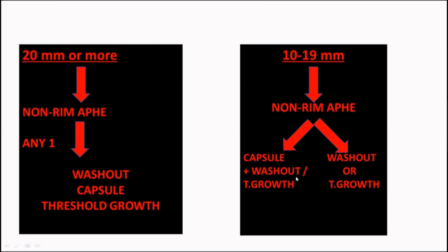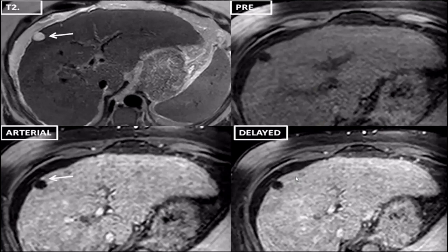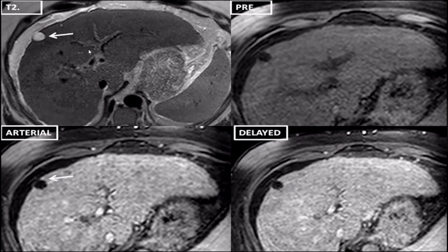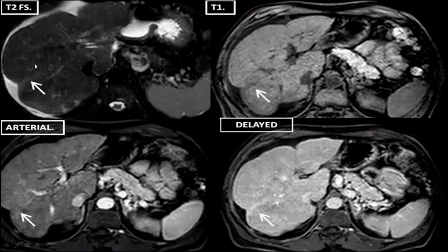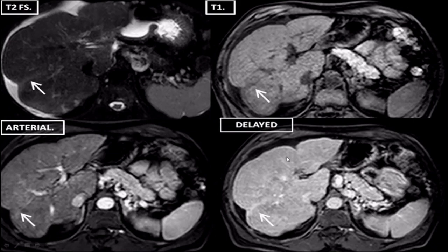In this case, we see a T2 hyperintense lesion in cirrhotic parenchyma, hypointense on T1 pre-contrast fat-saturated images, showing no enhancement in arterial or delayed phase — fulfilling criteria of a simple cyst, which falls into LR-1. In another case, there is focal T2 fat-saturated hyperintensity with associated contraction of the liver surface, hypointense on T1, showing linear arterial phase enhancement and persistent delayed enhancement — this was focal confluent fibrosis, a probably benign LR-2 lesion.